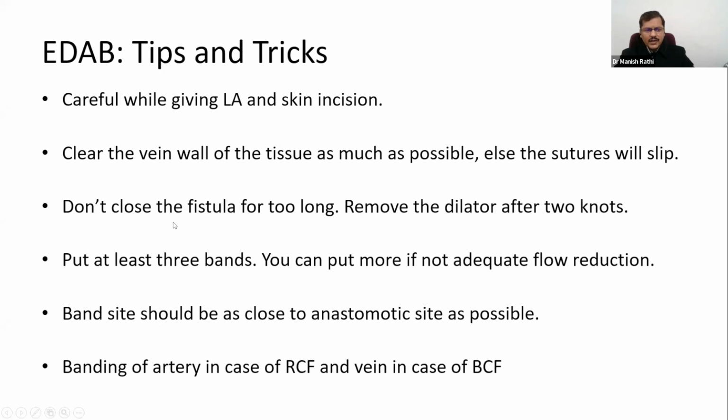The third important point is don't close this fistula for too long. Just put two knots and remove your dilator, because if you keep on waiting to put 4 or 5 knots, your fistula will get blocked.